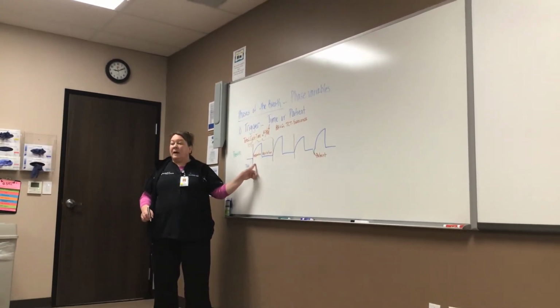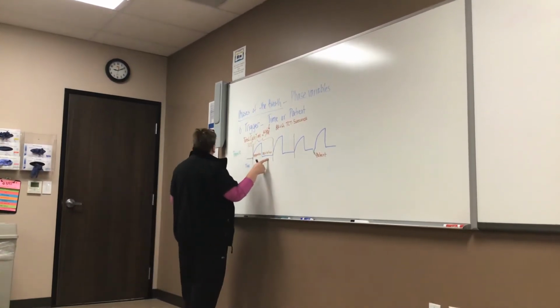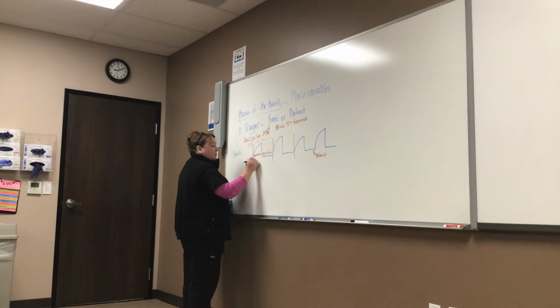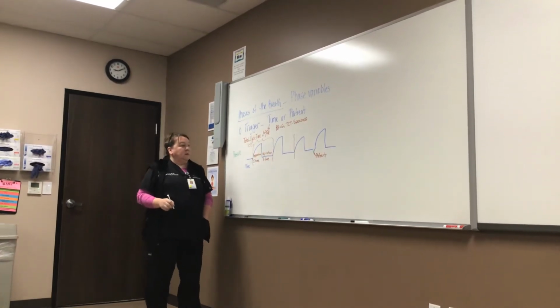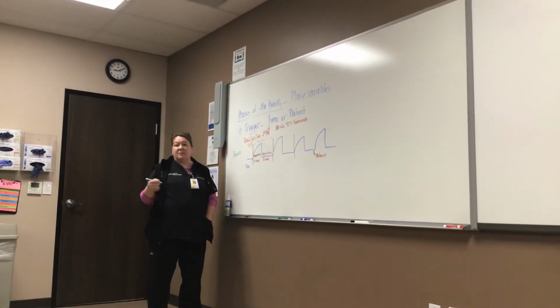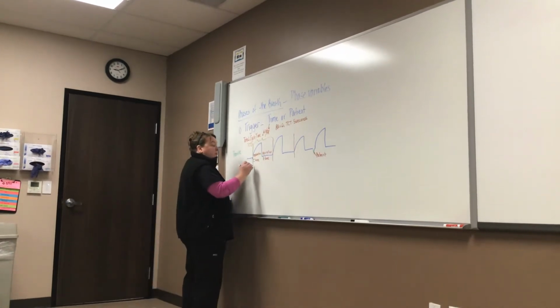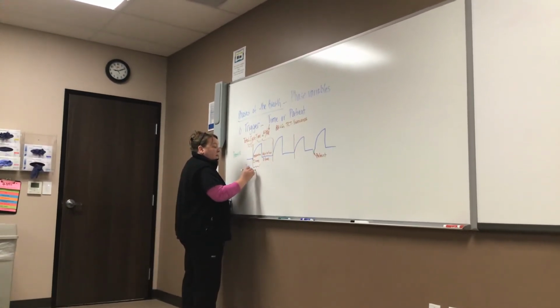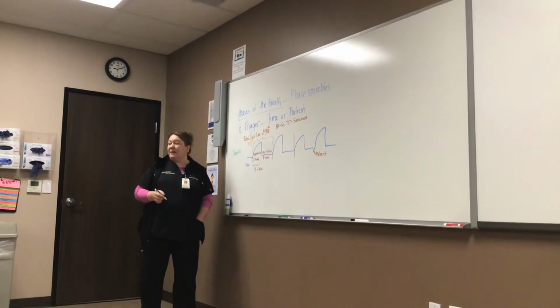This is where I time and E time exist. This is going to be your I time, this is going to be your E time. Inspiratory time, expiratory time. A lot of times it goes by I time, and we'll talk about E time. So normal inspiratory time is 0.8 to 1.2 seconds. 1 is a very good, happy I time.